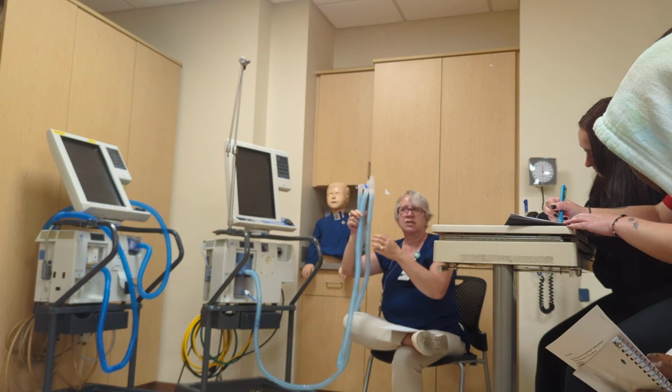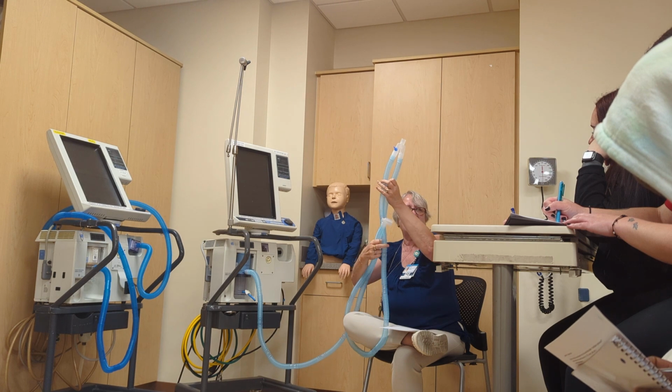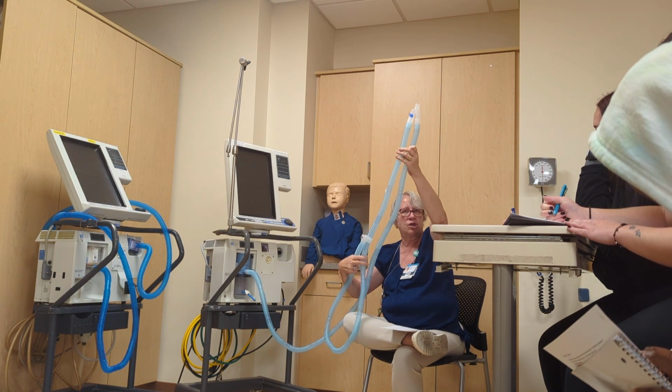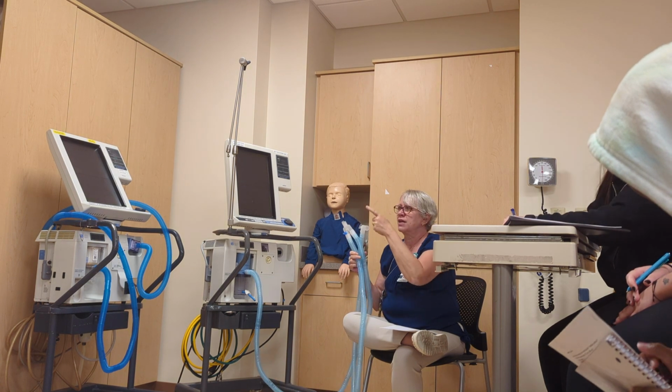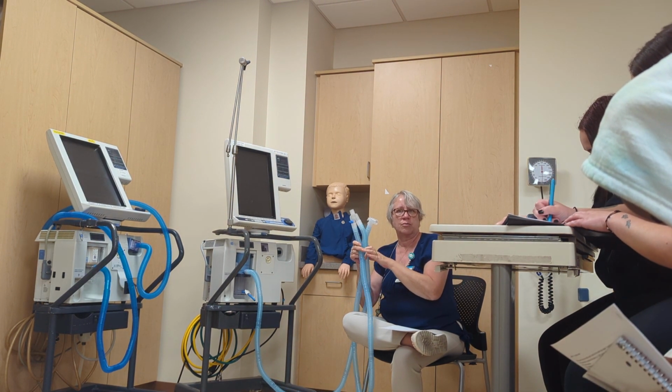Okay. So your inspiratory limb and expiratory limb is corrugated tubing. Large bore tubing. Small bore tubing is what we put on nasal cannulas. Okay, this is large bore tubing.